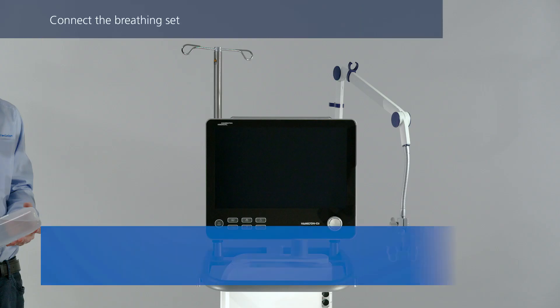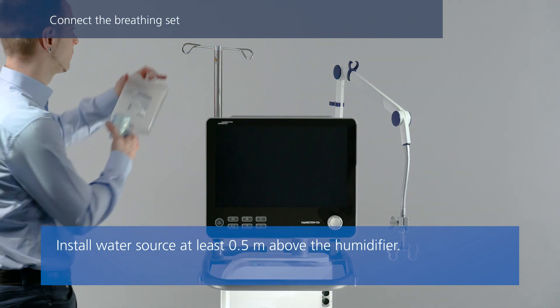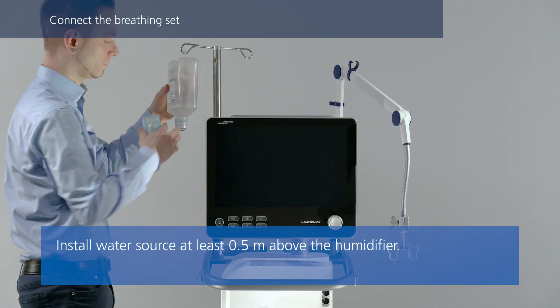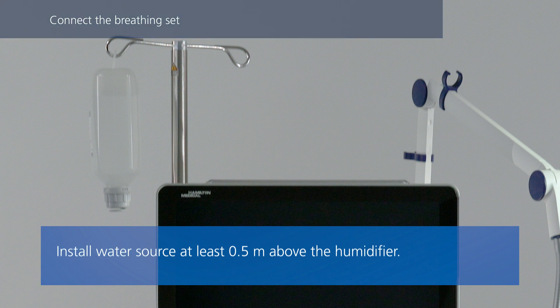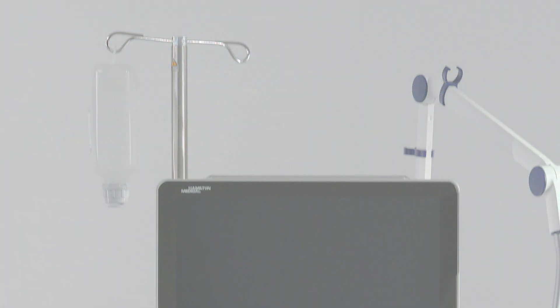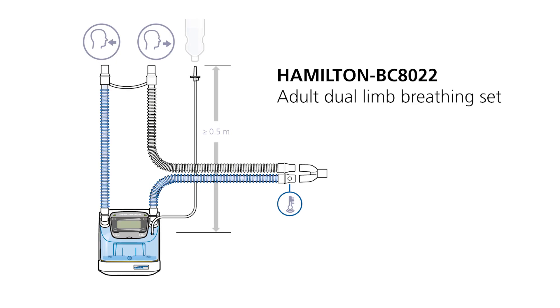Install a water bag or bottle above the humidifier. Choose the correct breathing circuit according to the patient group or selected treatment. The following information applies if you are using the Hamilton BC8022 breathing circuit or any other double limb breathing circuit for an active humidifier.